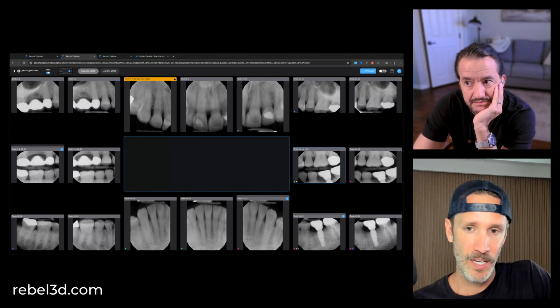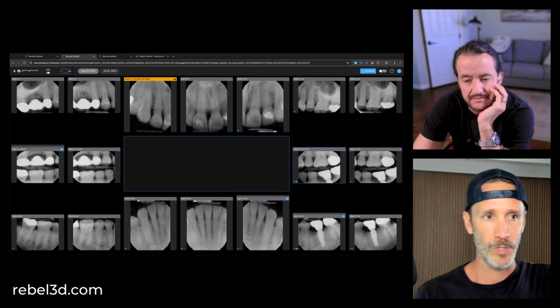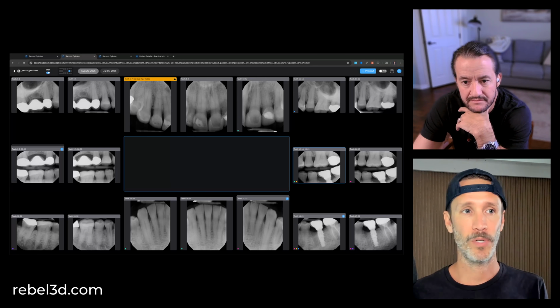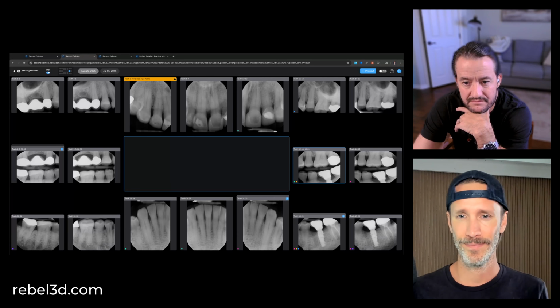Yeah, again, we didn't think of using this tool for that, but what people were doing is why we created that printout feature. People were saying, we're just screenshotting it and sending it to the insurance company. And we were like, oh, well, let us do that for you so that it's a little bit easier.